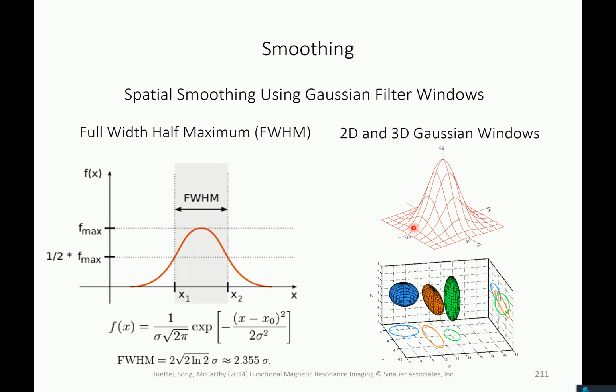If you want to measure activation, the signal, of course, is not random. So I was thinking this is kind of a distribution to apply a kernel to even out all the noise.